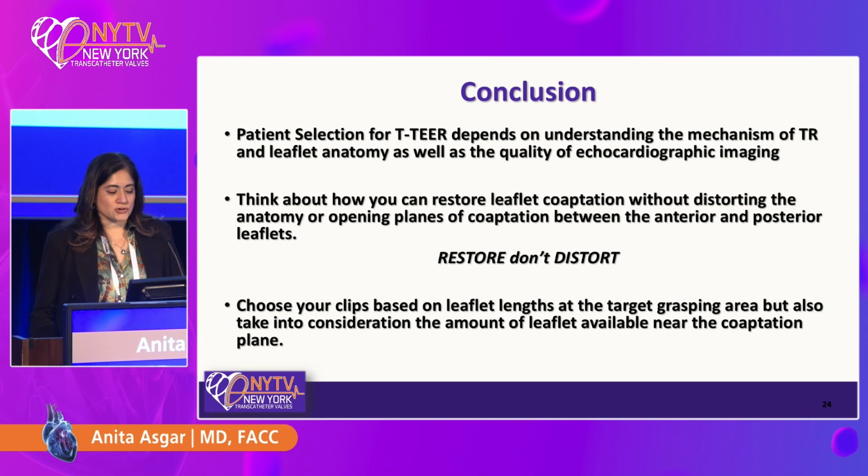And then basically choosing your clips based on your leaflet lengths at the target grasping area, but also look at how much leaflet is available. So not as simple as green, yellow, and red, but asking the right questions, I think, will get you to the right answers and help you to decide how to do a good procedure for your patients.